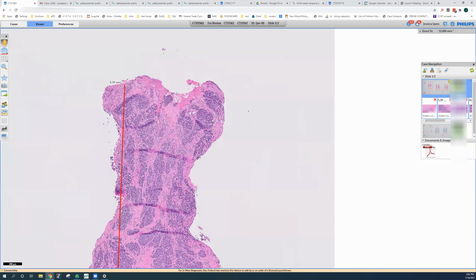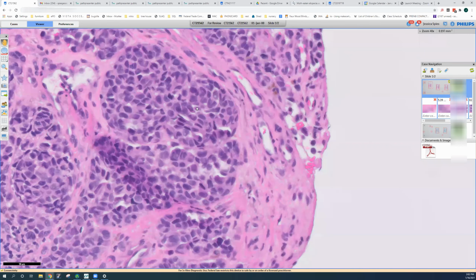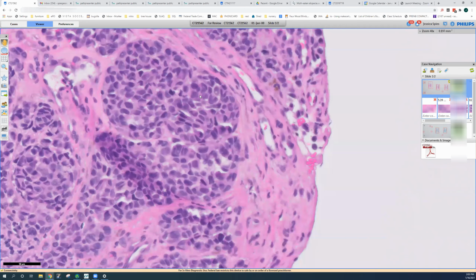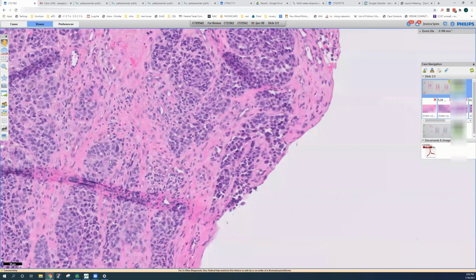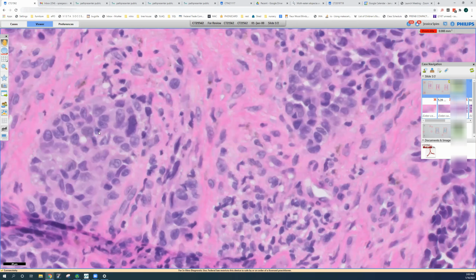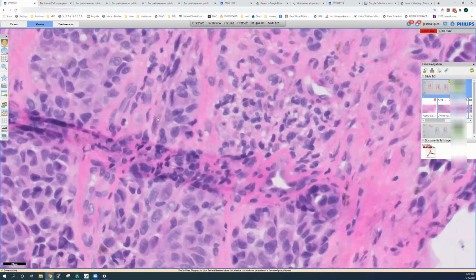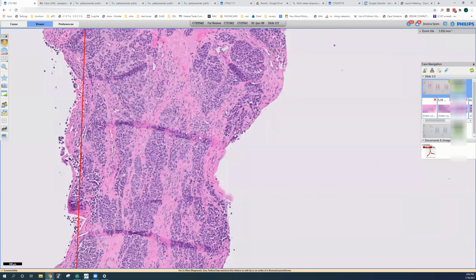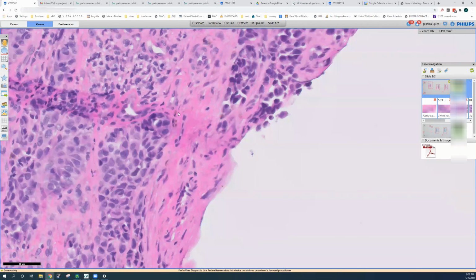And then here is this infiltrate of, similar to the last case, very pleomorphic cells. Hard to see big nucleoli in these. Actually, let's go over to this area. And smaller nucleoli than in the last one. But some of the cells do have melanin pigment in them down here. There are also some melanophages admixed.